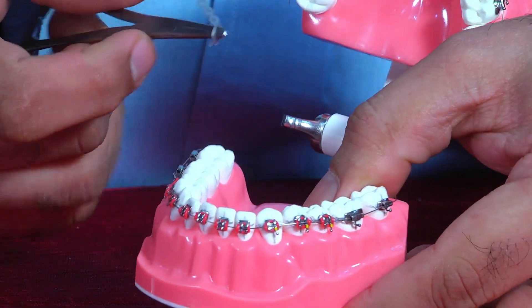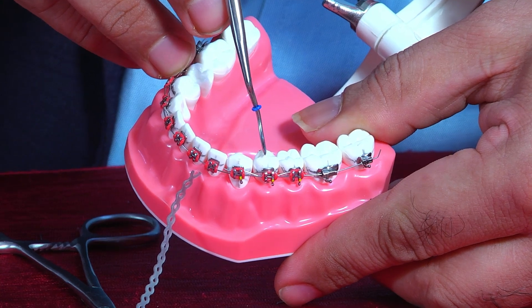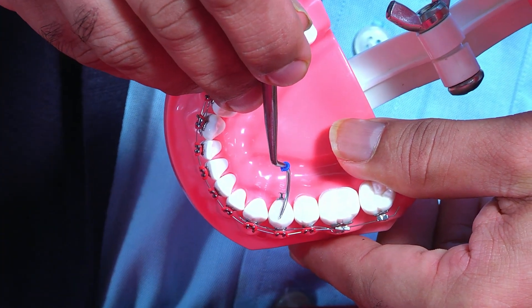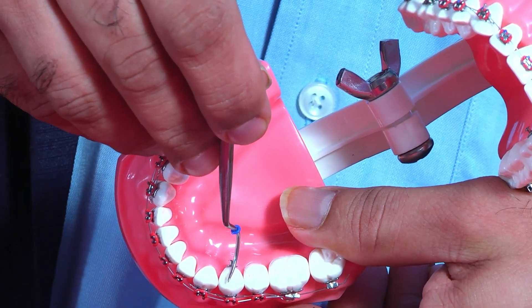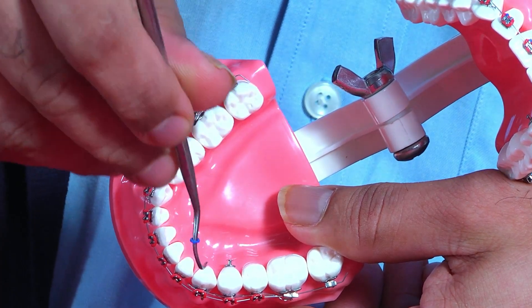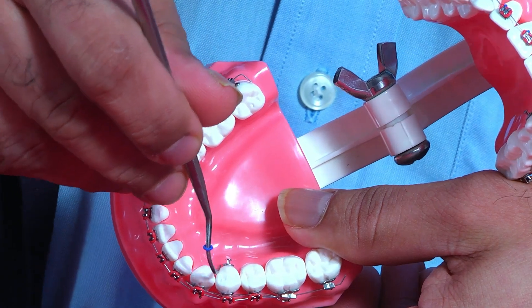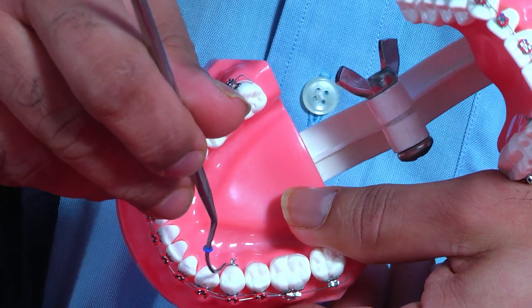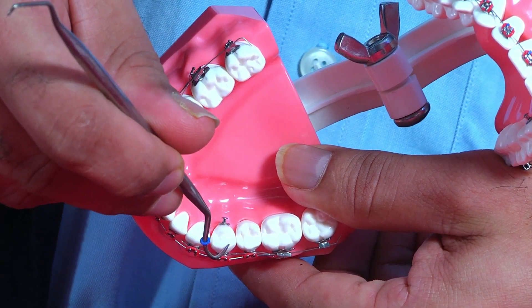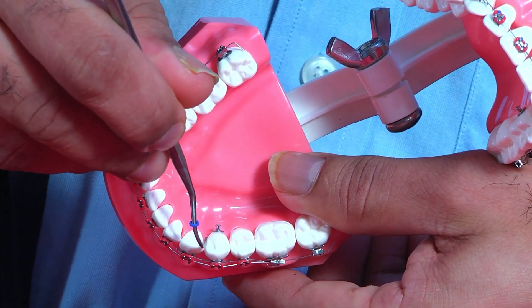Now, for rotation correction — you can see this is slightly rotated to this side. How do you describe rotation? You describe rotation from the mesial direction. This can be said to be mesiolingually rotated — the mesial part is a little bit into the lingual side. So, mesiolingual rotation.